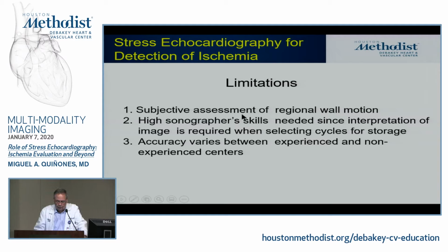So as a reader, you have to have a lot of skills in the subjective assessment of wall motion. Sonographers have to be skilled. And of course, you have this problem of the accuracy varying between experienced and non-experienced centers. And we see this, to be honest, with nuclear too.